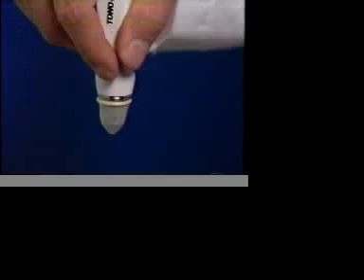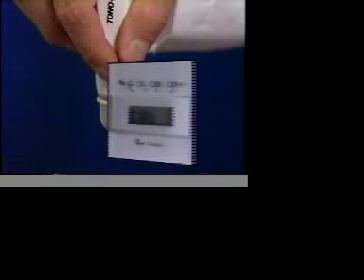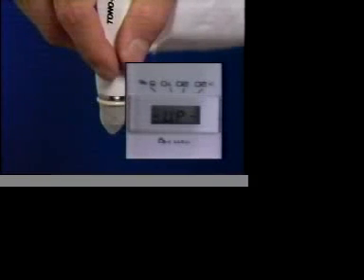The unit beeps twice, and the letters C-A-L for calibration appear on the display. Within a few seconds, the TonoPen will beep again, and the word UP will appear on the display.